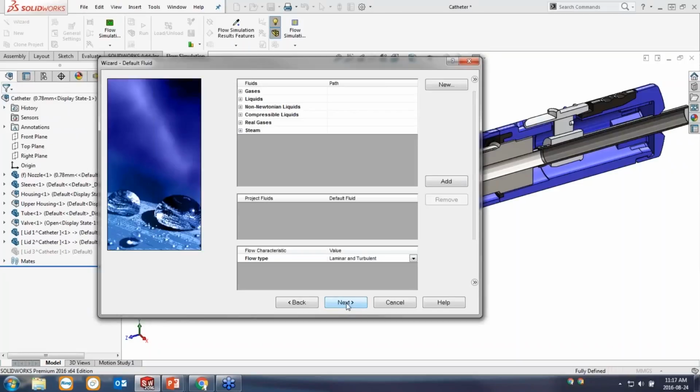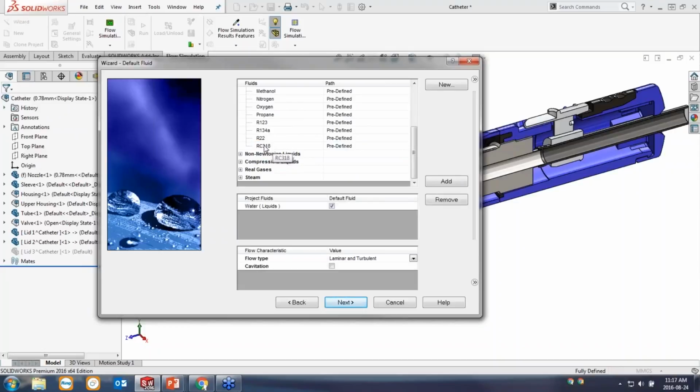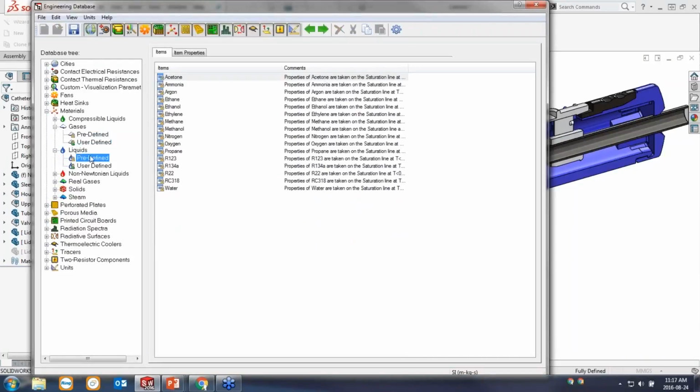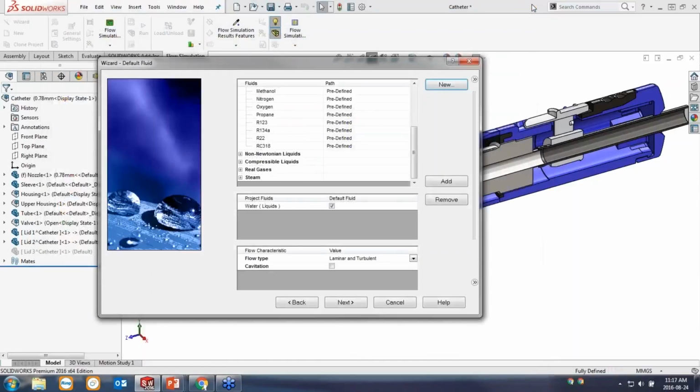The next step in the wizard is for us to choose our fluid. And this is going to be delivering a liquid medicine. And so I'm going to be choosing water as my liquid. But if you had a specific liquid that you needed to choose or a specific fluid, you could type in your own custom properties here. At this point, using this water, what I'm really doing is I'm harnessing our engineering database, which is full of lots of predefined fluids, predefined materials, and my water has this data associated with it. So I'm extracting the density of the water, the viscosity of the water, and that's automatically included as soon as I choose that fluid. All right, and so this is probably going to be pretty accurate if I've got some sort of aqueous solution being pushed through this device. But we'll actually come back later and we'll switch this up and see how much the effect of a different fluid is on this particular design.